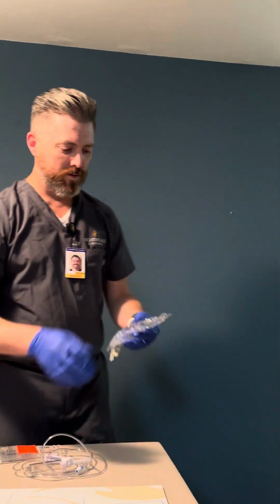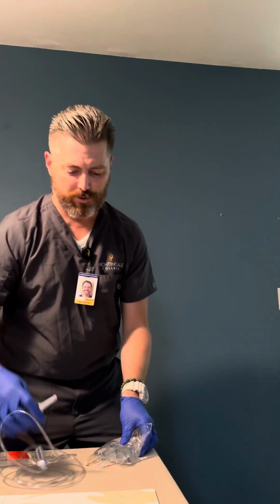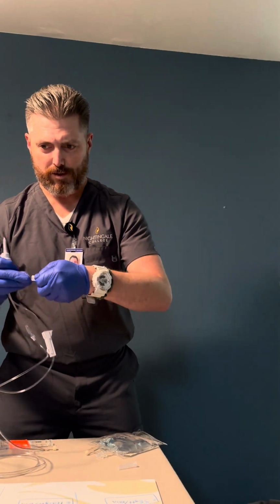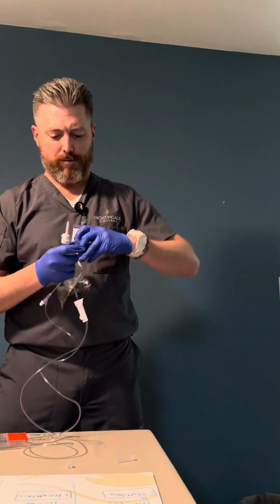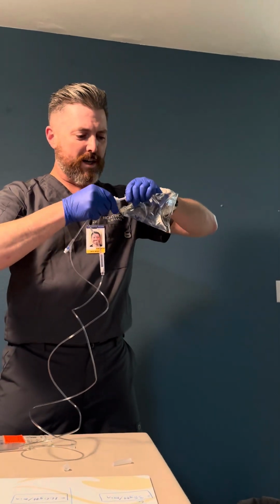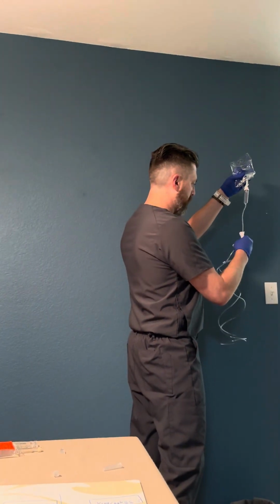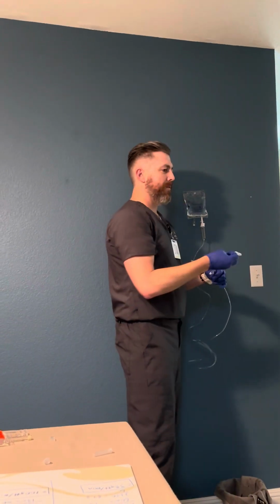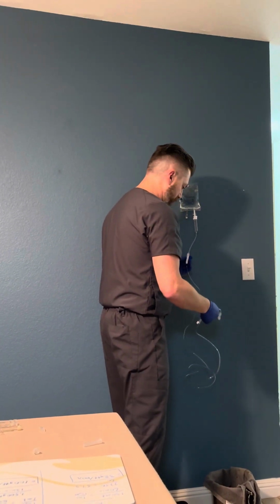So I will first take our saline. I'm going to spike it first, so I'll remove the spike. I'm going to remove the little adapter end. Move the end of this for the bag. Insert the spike end all the way in, and we'll make sure we're clamped. We're clamped right now. I'm going to hang it 30 inches above the site, the IV site of the patient, and we're going to open.